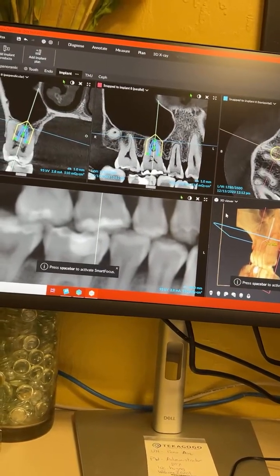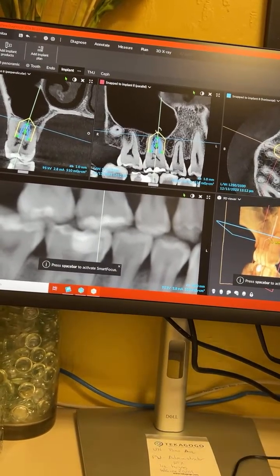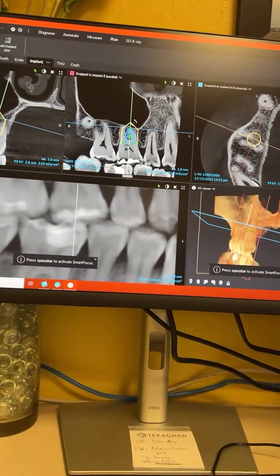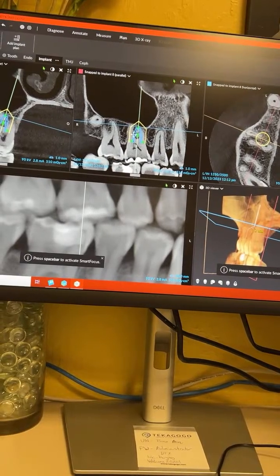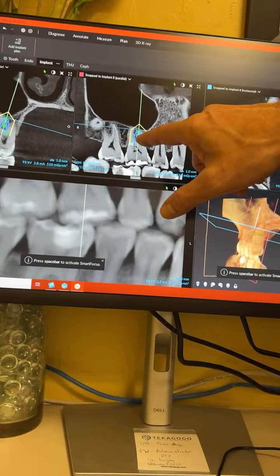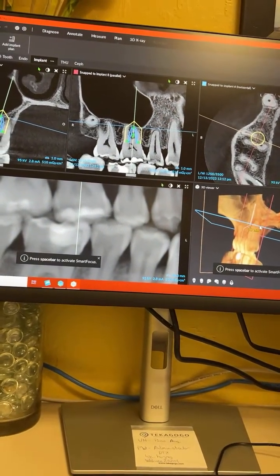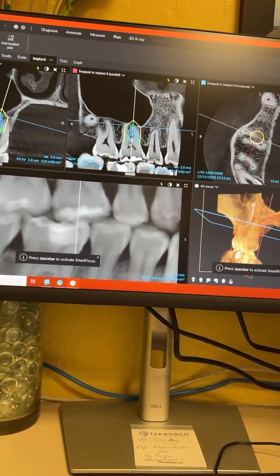Okay, right there. So can I ask you what the yellow represents? The outer border of the implant. Oh, I'm sorry, that's the profile. Just the profile, but the implant's right here. Okay. That's spacing around it. And what is it right here? That's your axial and sagittal views.